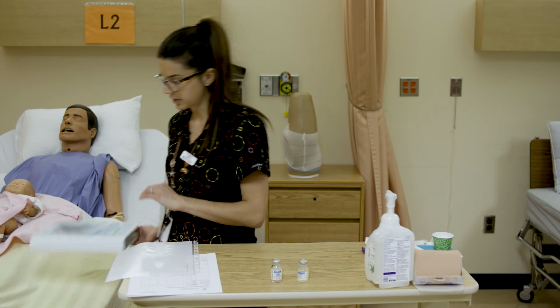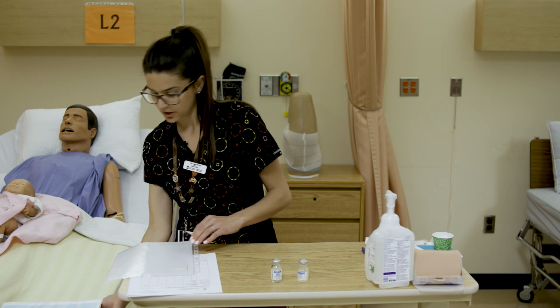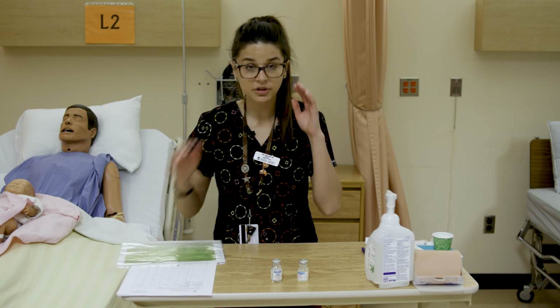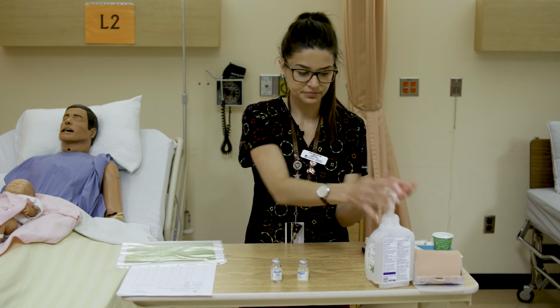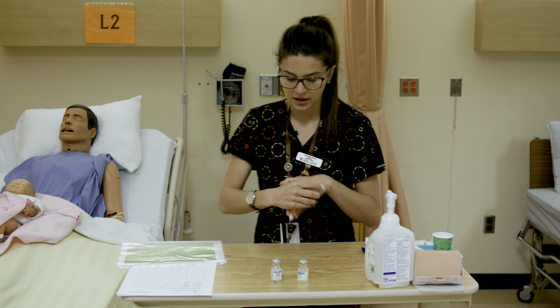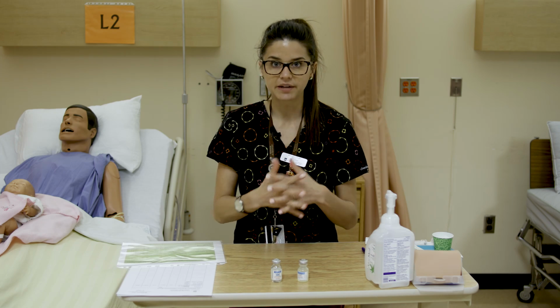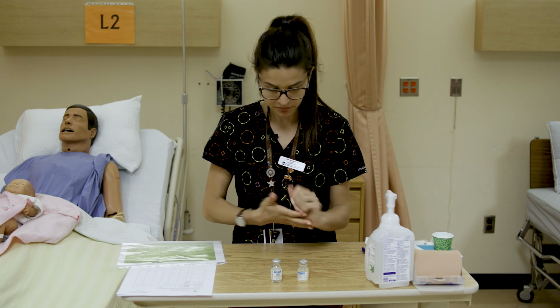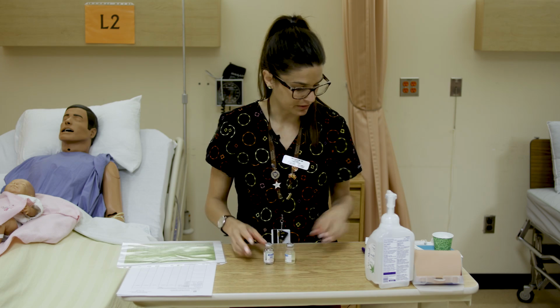So we'll just put our monograph aside for now. We've gotten what we need from it for now. Again, you'll want to have your drug cards or your drug guide available to know more of the indications, contraindications, side effects, those kinds of things of your medications as well, right? So we're going to get these ready now per those instructions.